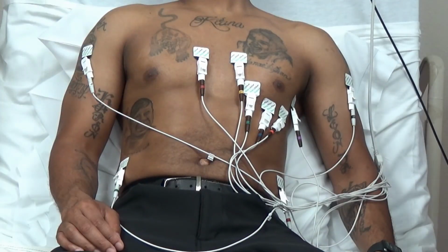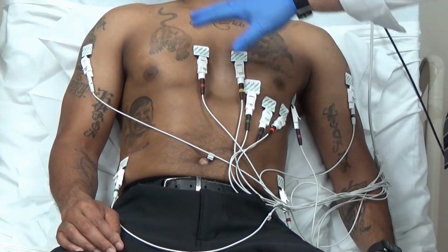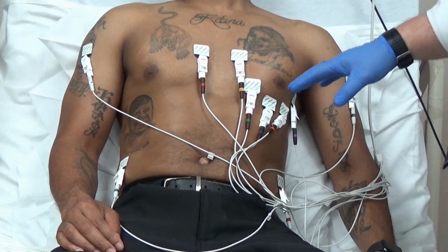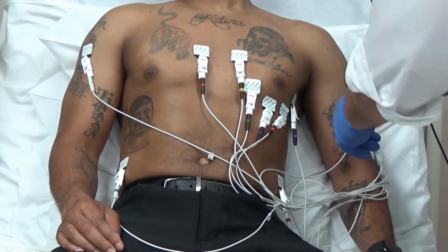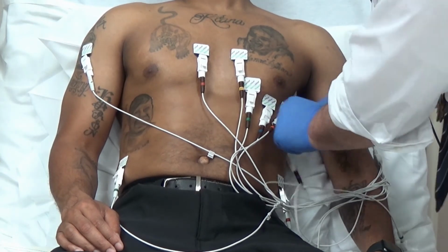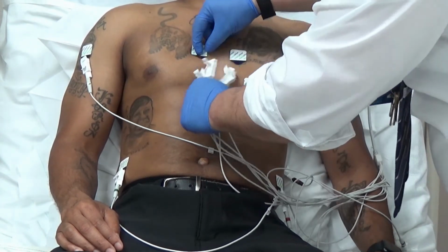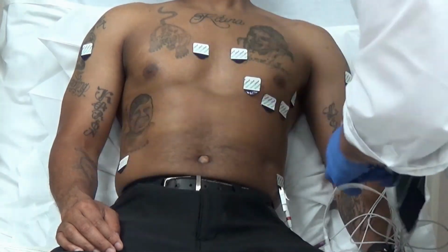Okay, so now when you're removing these leads from the patient, you want to be careful because this is sticky. You may have patients with hairy chests, so you want to definitely be aware of that. Usually what I'll tell the patient is, hey, I'm going to remove these leads from you. First thing I'll do is take all of this off right here. These ones are nice, they just clip on. That's how most of them are in the hospitals anyhow.